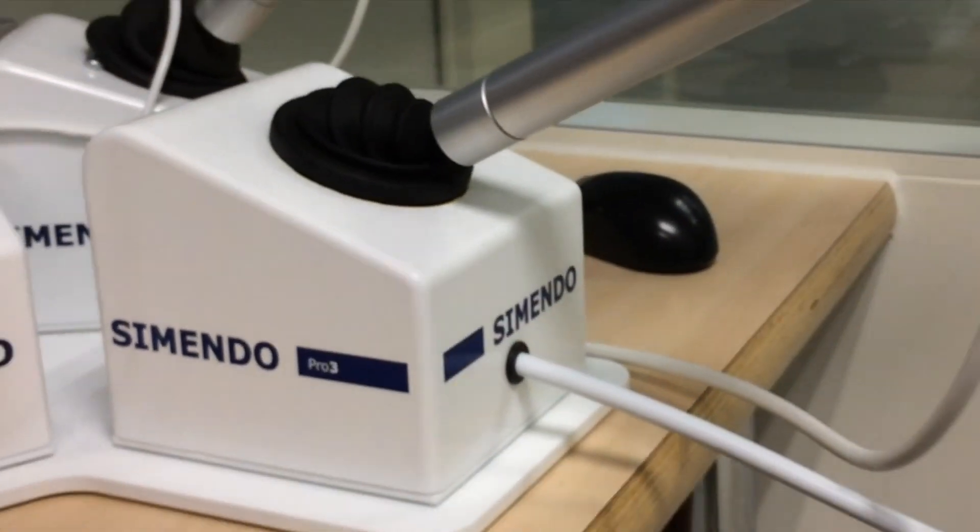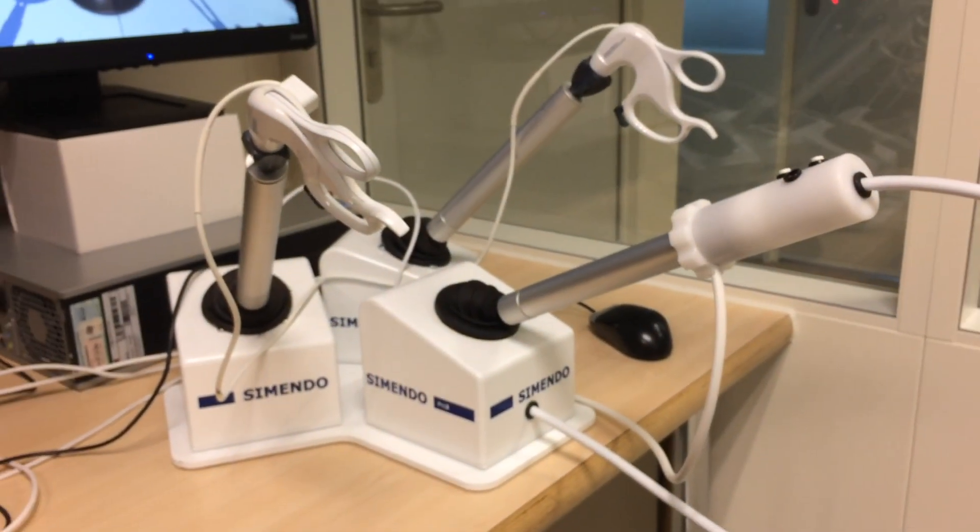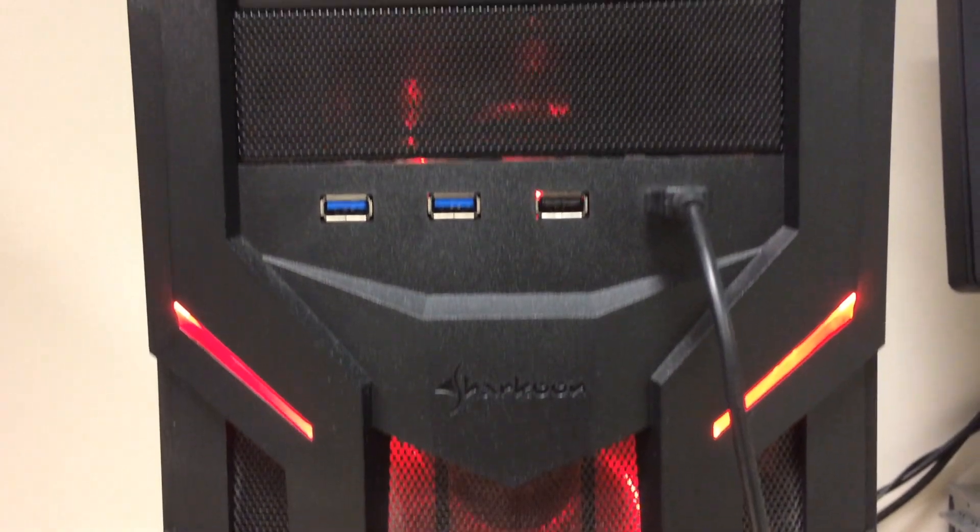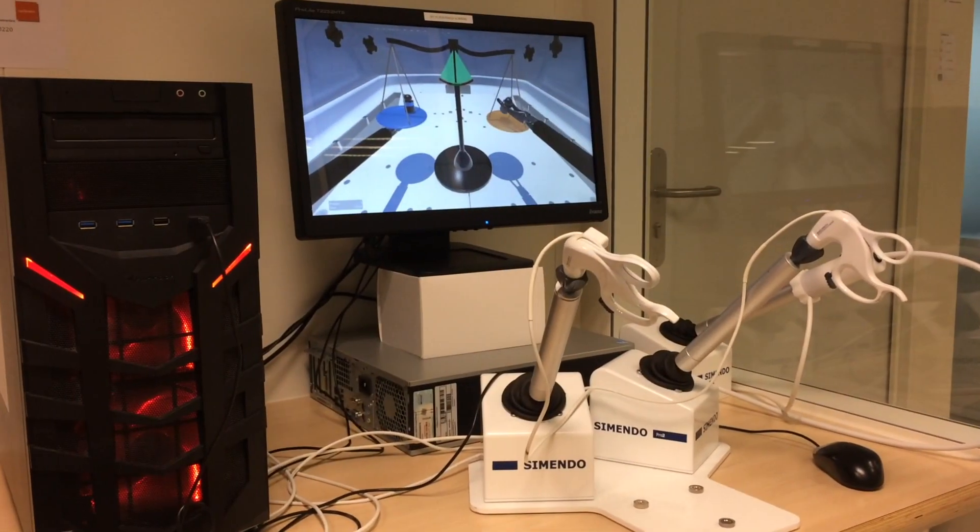This is the Simendo laparoscopic simulator. Unlike most simulators, it uses a normal gaming computer and stationary controllers.